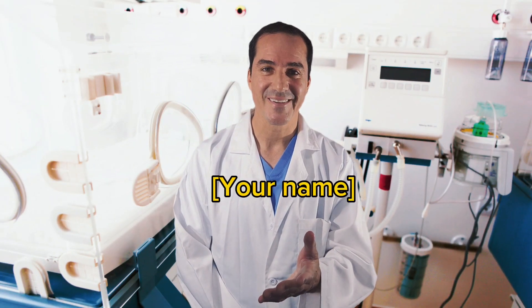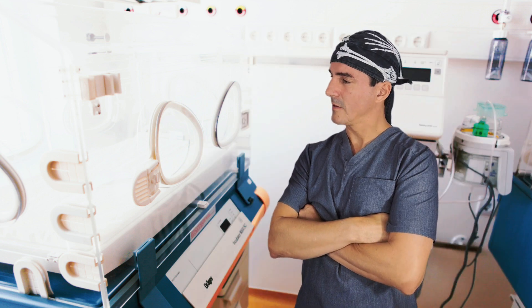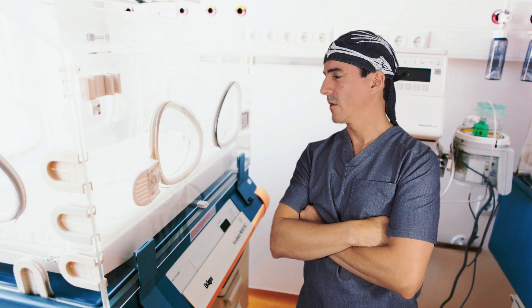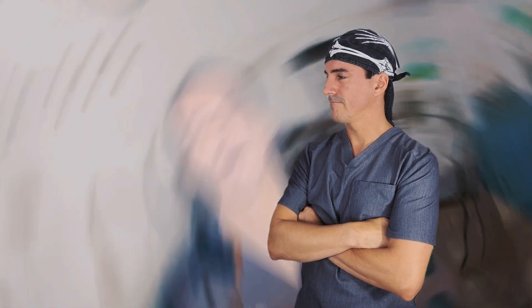Let's get back into the NICU and find out what Dr. Ford and the nurse and Rick do. We're going to go ahead and start with those settings and we'll see how the gas responds to that. Personally, I would probably add a little bit more amplitude, but we'll see where the wiggle ends up.